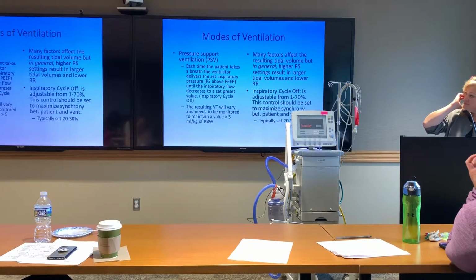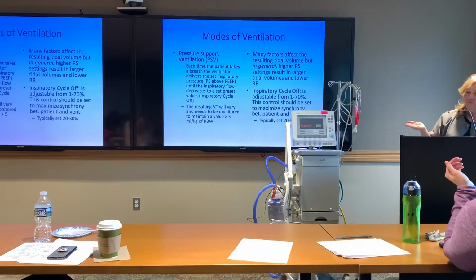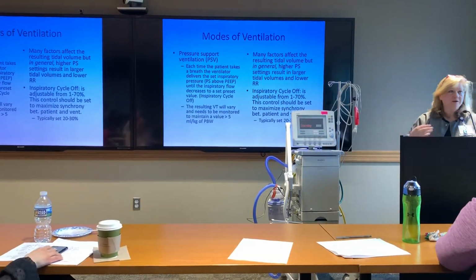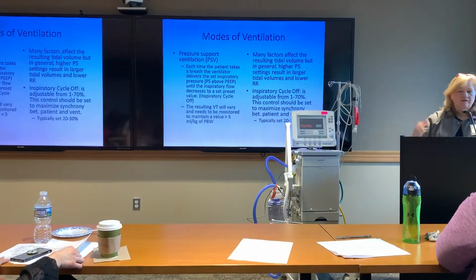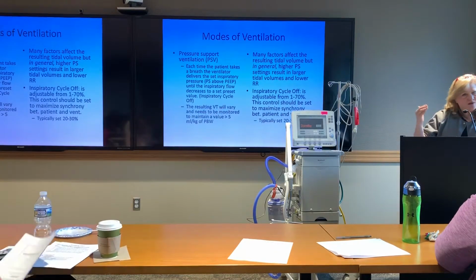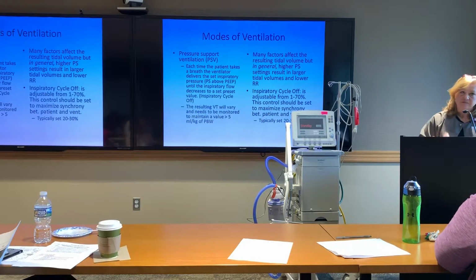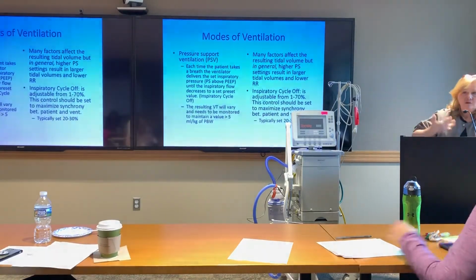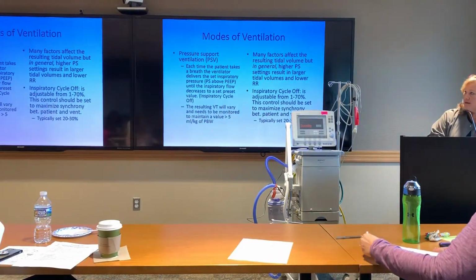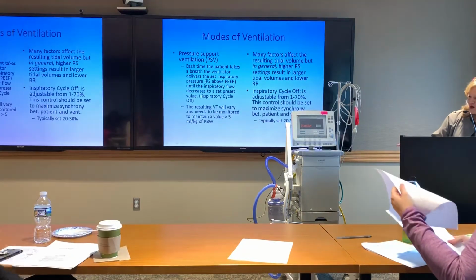All right, so I kind of went into a lot of this on pressure support, but I think you guys use that mode a lot. Your patients are on a lot of pressure support, as they should be, because sometimes they just want to do what they want to do, and the best mode that will meet their demands is pressure support. The other ones, that mechanical breath sometimes just gets in their way of what they want, how much flow they want to get. So anyway, every time the patient takes a breath, it goes up to that pressure level, and then it's going to taper off.